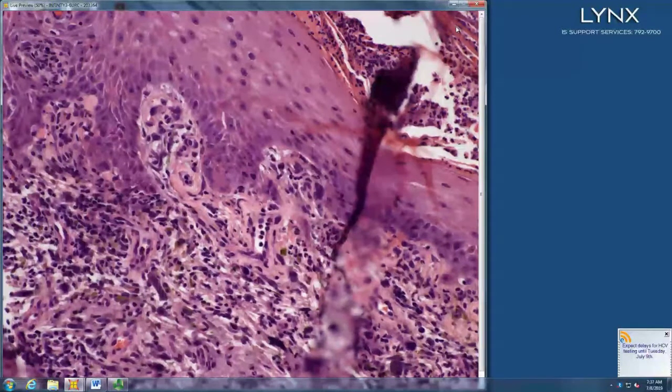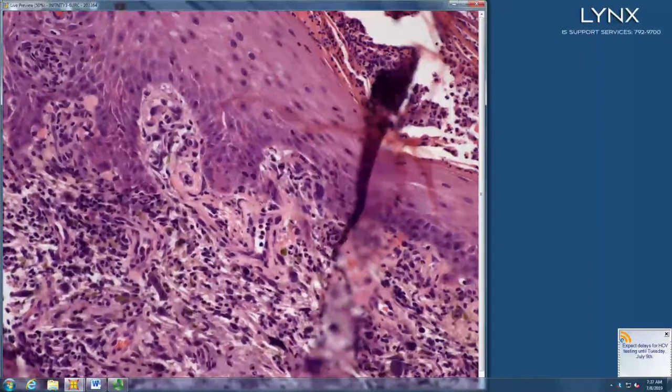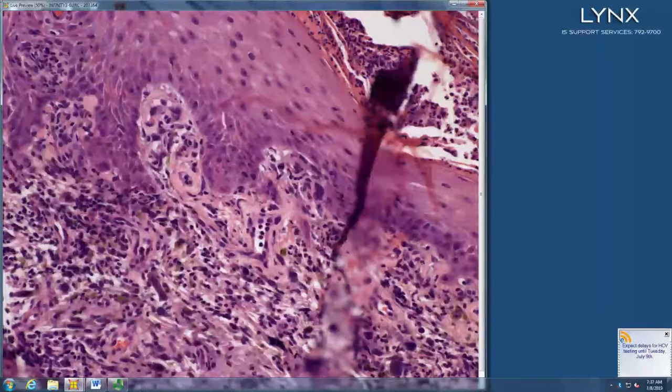And then like a MART1... how good is that in spindled melanocytic proliferations? Not very good. So like a SOX10 or S100, which would still be reliable in spindled. HMB is totally unreliable when it's spindled. MART1 is like 50-50, and SOX10 and S100 are very reliable in spindled.